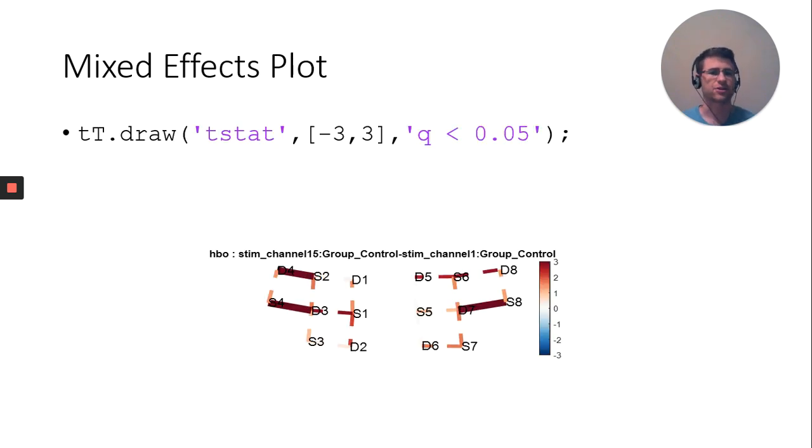To draw that, you can plot your results. You can use a threshold to look at the effects. I do the output dot draw, specify it's the t-stat I want to draw, specify a legend threshold. Here it goes from negative three to three. If those values are too big, all your values look white, not very useful. If they're too small, several max out, also not useful. Here I have q, the corrected p value less than 0.05, so I have these statistically significant channels.